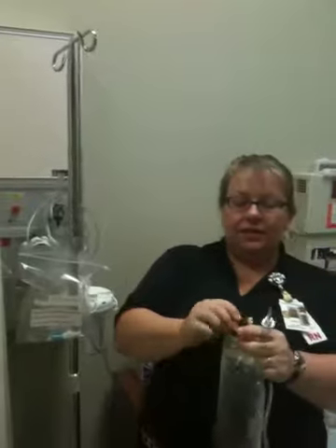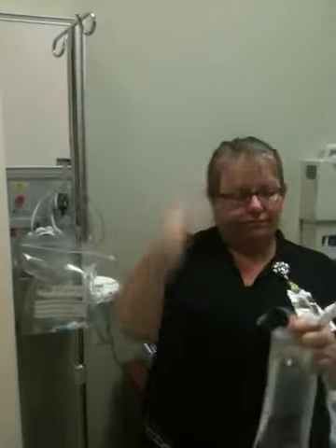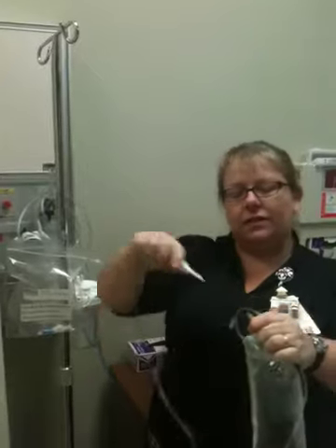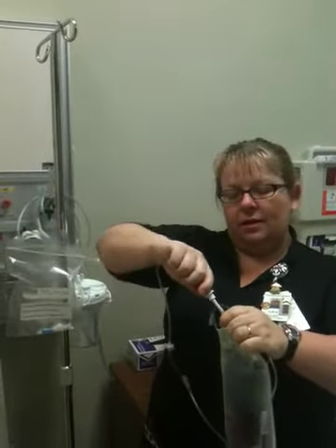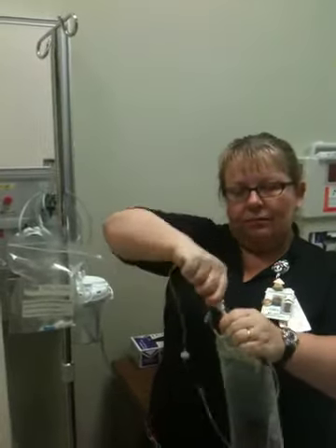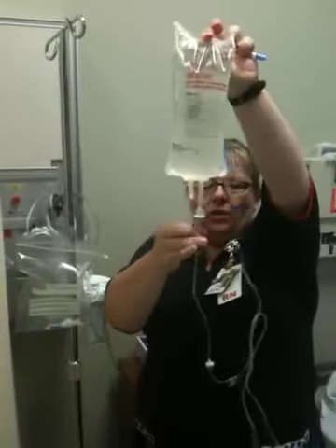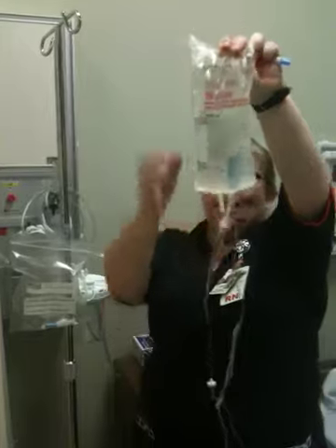Take your bag. This is your medicine port — pop the top of that off. Throw it at whoever's standing next to you. It goes in — make sure it's secure. And flip your bag back up. You're going to squeeze that chamber until it's about halfway up.